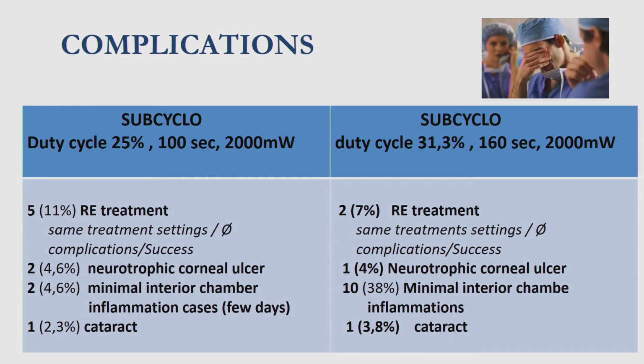And we haven't found any severe complication. There were only some cases of retreatment, and more inflammation in the group treated with duty cycle 31.3%.